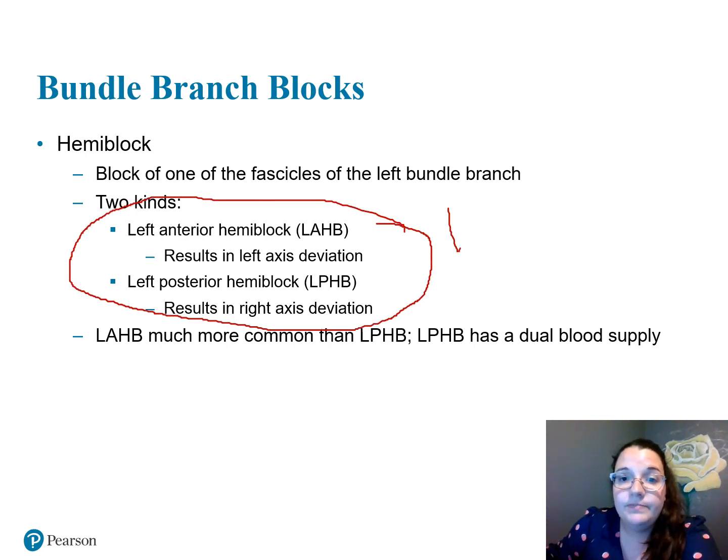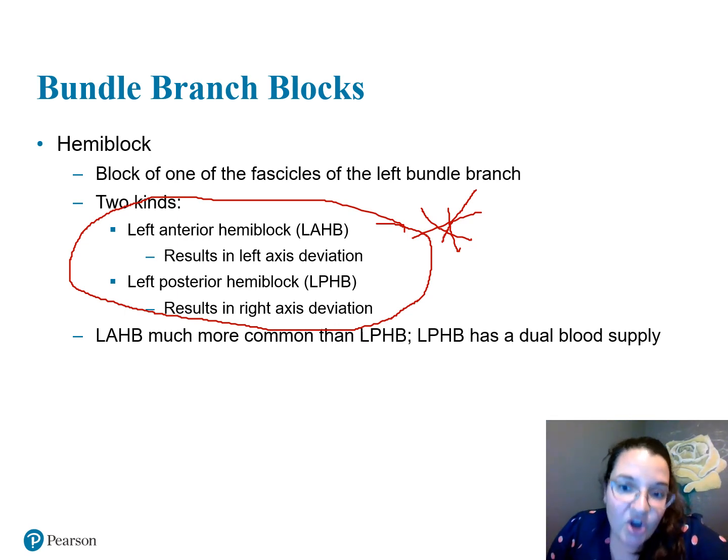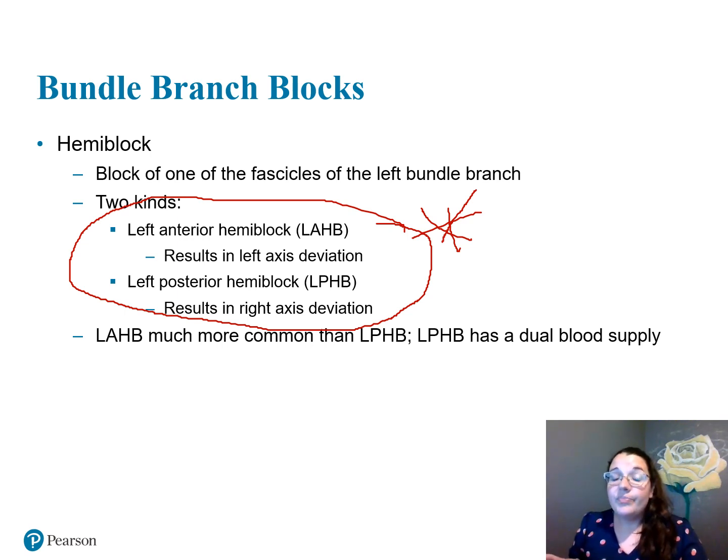Very important. It gets very confusing when you start talking about LBBB, RBBB, LPHB, LAHB, RAD, LAD, normal, indeterminate. You can already see how confusing it can get. What leads do I look for axis determination? What leads for BBBs?